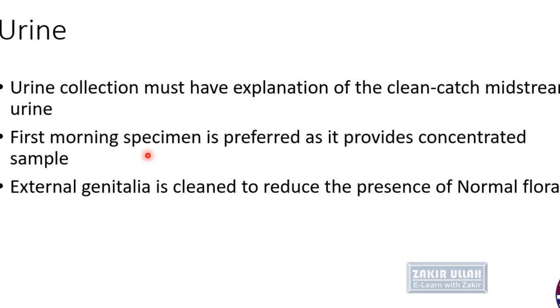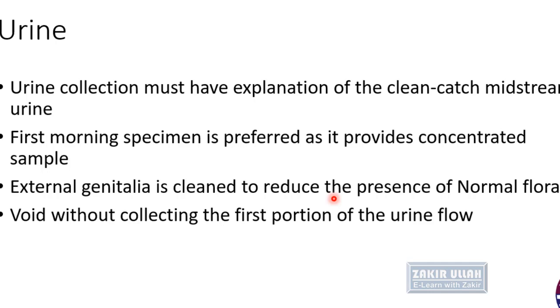For urine collection, first the external genitalia is cleaned to reduce the presence of normal flora, because we know that our skin is inhabited by the normal flora, different types of bacteria or some types of yeast cells. So by washing the external genitalia, the normal flora is removed.